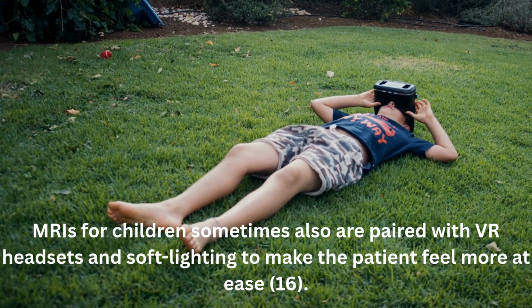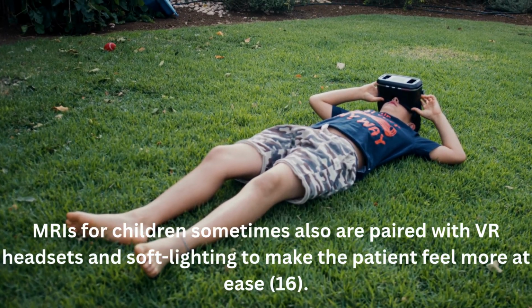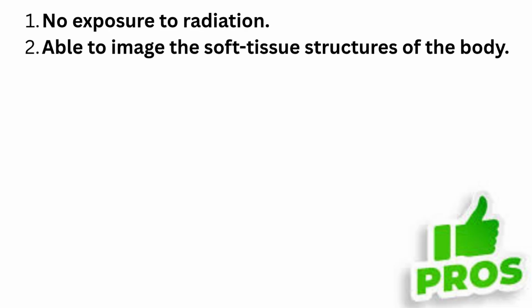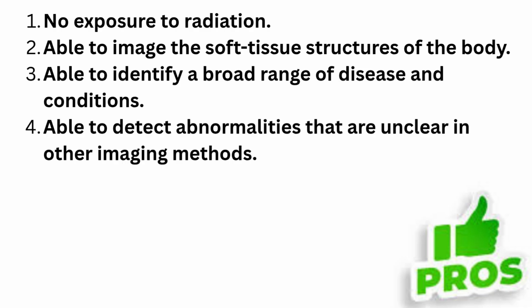MRIs for children sometimes also are paired with VR headsets and soft lighting to make the patient feel more at ease. What are the benefits to using MRIs? First, MRIs are a non-invasive technique that doesn't involve exposure to radiation. It is able to image the soft tissue structures of the body and is able to identify a broad range of diseases and conditions. It is valuable because it is able to detect abnormalities that are unclear in other imaging methods.